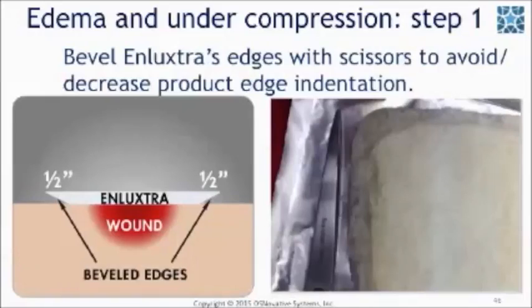When using Enluxtra for edema and under compression, first, using scissors, form a bevel of up to ½ inch wide around the entire dressing edge on the wound contact side and place the dressing on the wound. This will help prevent dressing edge from indenting into the surrounding tissue.